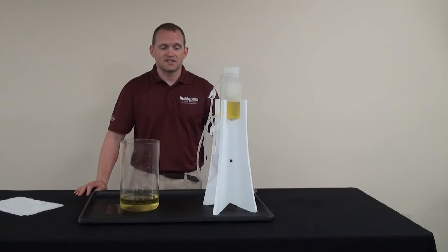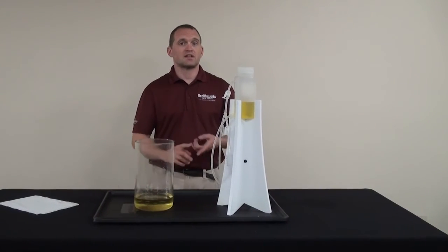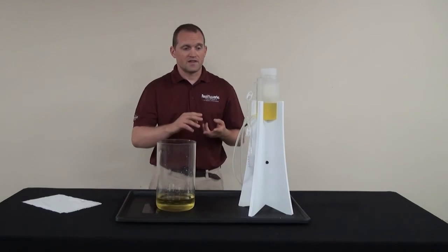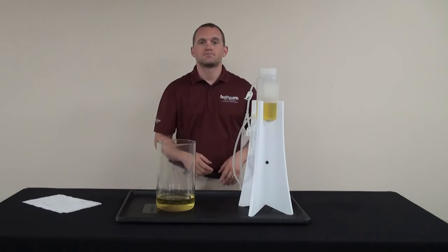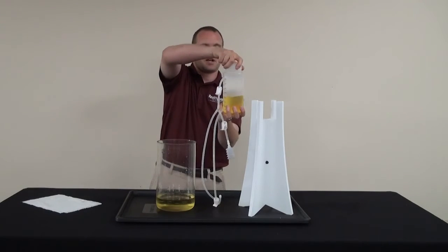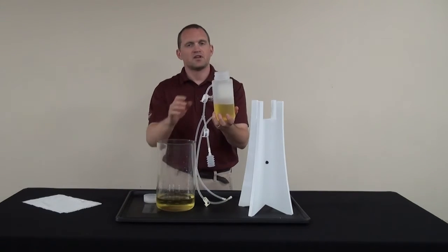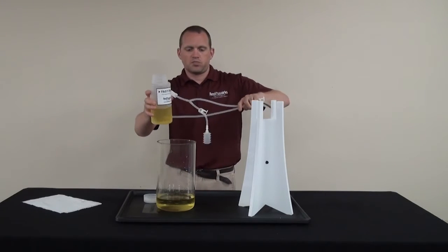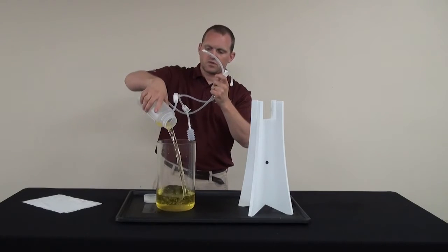After you have disconnected the bladder and genitalia, make sure you have cleaned the bladder and emptied out all the water, and then clean the genitalia with warm water. You'll want to empty out the excess liquid. Begin by taking the cap off and do this over a sink, and then pour out the excess liquid.